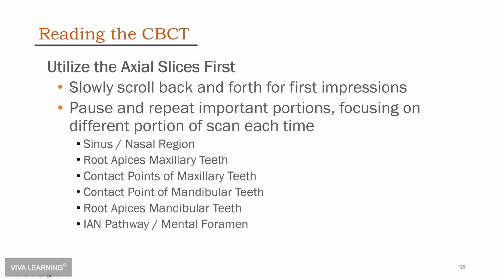And of course, you're going to take more time once you're in there with the patient and you're talking with them about their chief complaint. So let's start with the axial slices. We're going to now break down exactly what you just saw. And the first thing I'll do is look at axial. That's cutting the patient horizontally. And we're going to slowly scroll back and forth with first impressions.